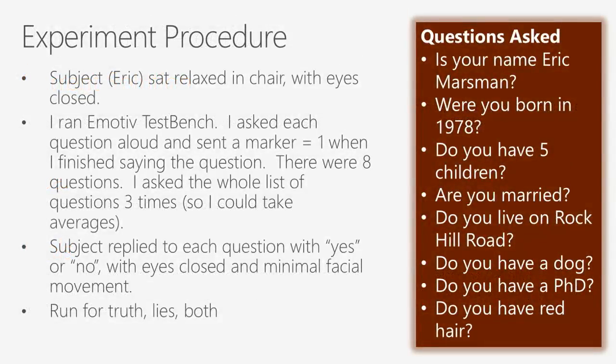So my very first experiments were all on my husband, Eric, the sainted person that you have seen in the keynote. And the procedure that I used is I had him sit down in a chair, relax his face, and close his eyes. I had him close his eyes for 2 reasons. Number one, I wanted his face relaxed because you guys saw how facial movement actually affects EEG.